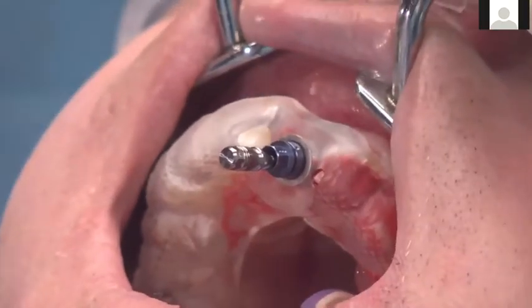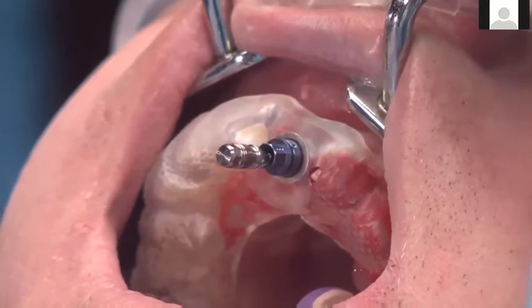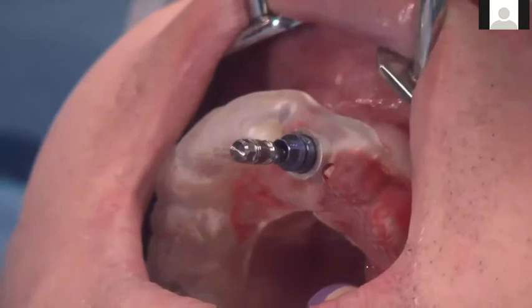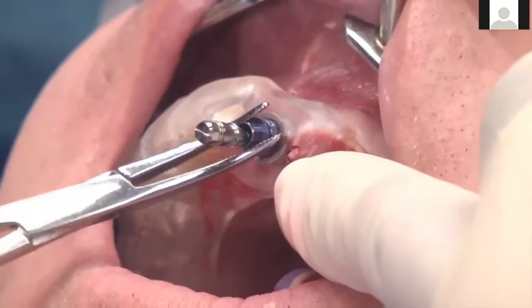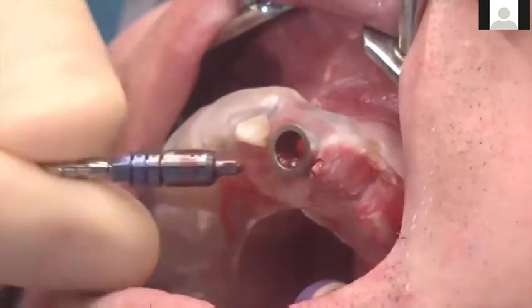But if it does reach enough stability, you can either temporize it immediately, or if you don't want to temporize it immediately, such as in this case, because this was a narrow diameter implant and we were doing some connective tissue grafting too, then you can go ahead and basically do a custom tissue former. This is just the removal of that guided mount.